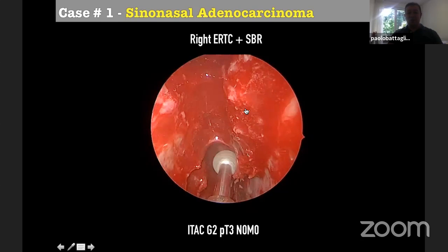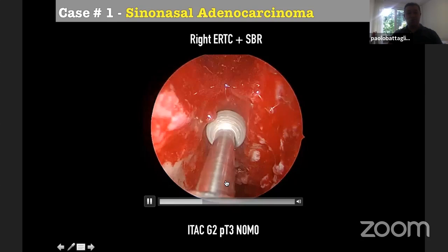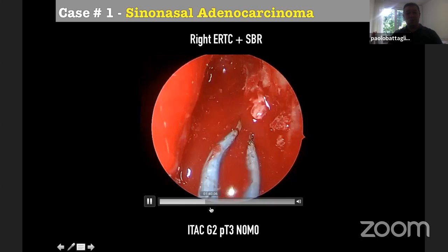So later on, we drill at the level of the olfactory cleft, at the level of the periorbita, and we drill at the level of the anterior roof of the ethmoid.